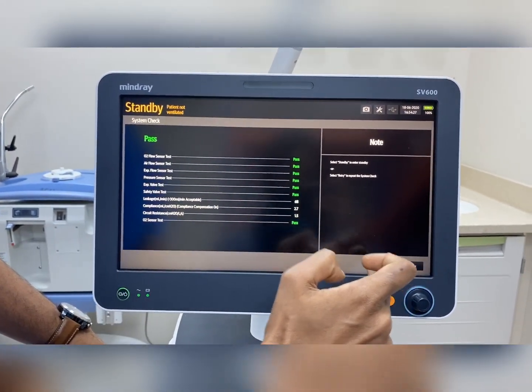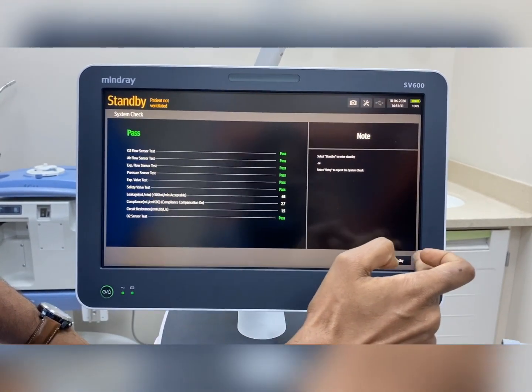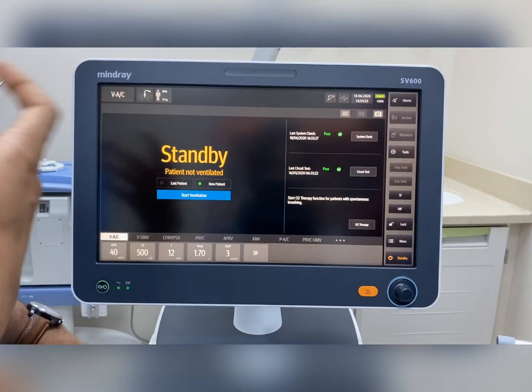Here there is a retry option — if the calibration has failed we can use the retry option; otherwise we have to go to the standby option to operate the machine.